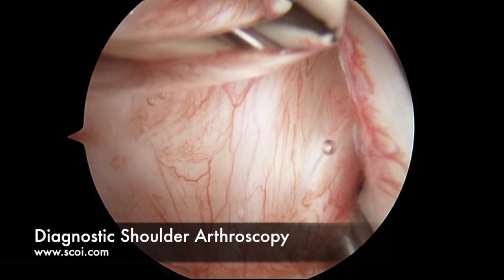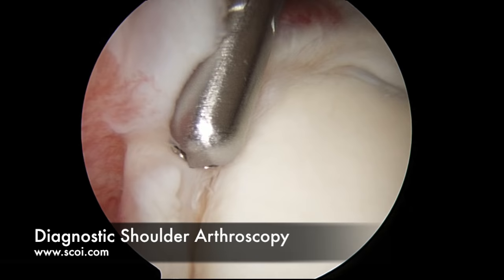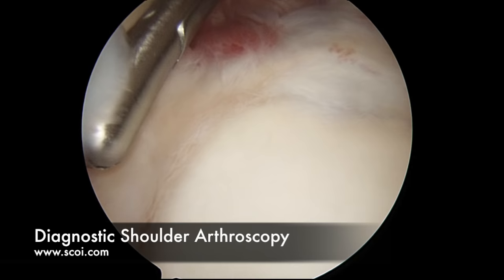The biceps inserts onto the superior labrum. The labrum is a ring of cartilage that runs around the socket circumferentially. This is the labrum here, and the very top of the labrum is where the biceps inserts. We pull the biceps back a little bit — there's a little cracking there, but that's a normal variance. If you tear this off, we call that a SLAP tear — a superior labral anterior to posterior tear.